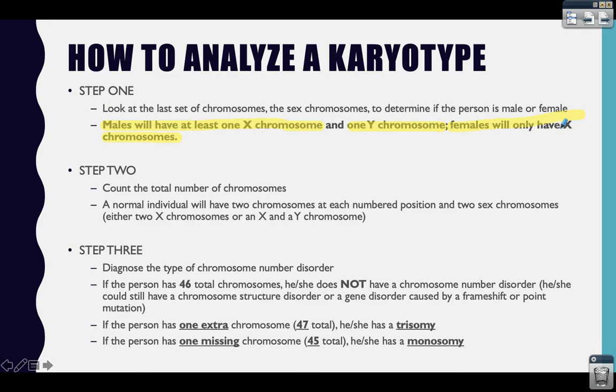You may have disorders that involve sex chromosomes where the person is missing one or they have an extra one. The next thing you want to do is count the total number of chromosomes. Chromosomes occur in pairs, so a normal person is going to have two chromosomes at each numbered position. They should also have two sex chromosomes — meaning two Xs, or an X and a Y.